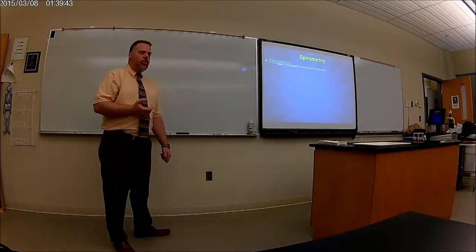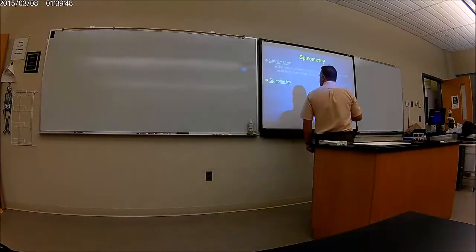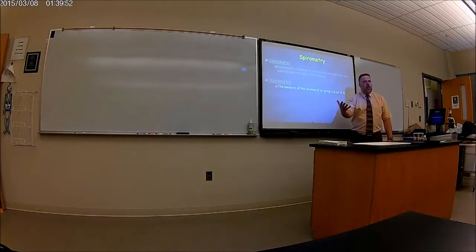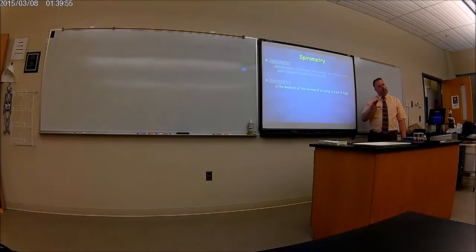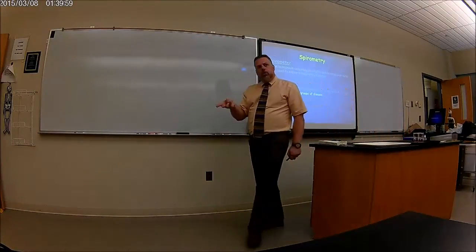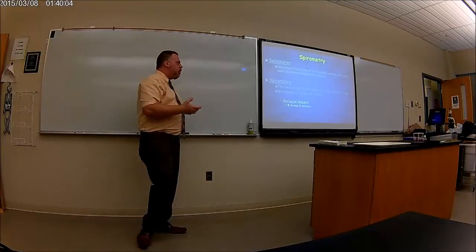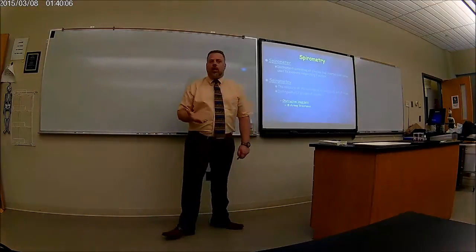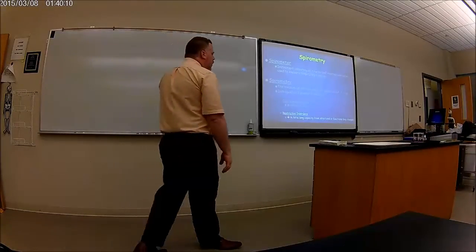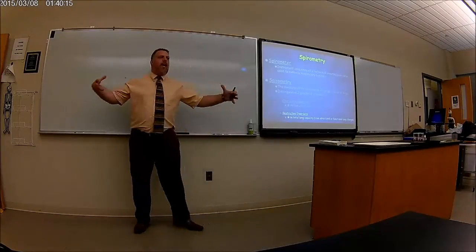use a spirometer to do this, okay? And that's what we use the machine over here for. So you do spirometry. It's a measure of the volumes of air going out of the lungs and into the lungs. You've got to compare those two, okay? So it distinguishes between the two groups of diseases, whether obstructive diseases, which means that something's going to block or obstruct the airway someplace in there, or a restrictive disease where something is going to restrict the lungs from expanding.